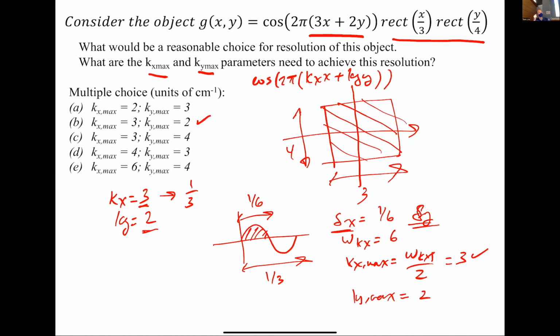Because if you have all the time in the world and you really, really want to see something in detail, and let's say you can take the brain out of someone's head and scan it for 24 hours, then you can say, I want a resolution of like 100 microns, right? But if you're in an emergency situation or you want to go really fast through someone's brain, then you might be okay with 3 millimeters, because if I have to go to 1 millimeter, it's going to take too long, the image won't look as good. And so it's just always a trade-off, okay?